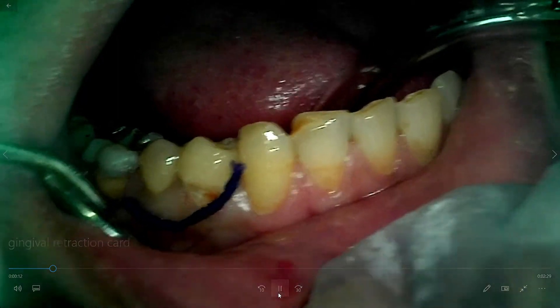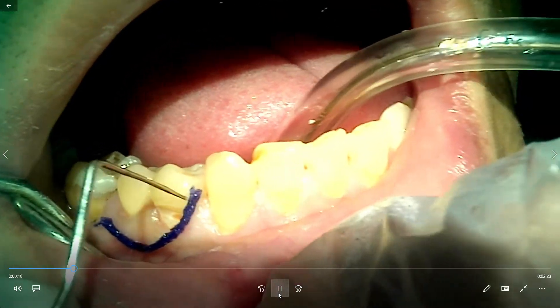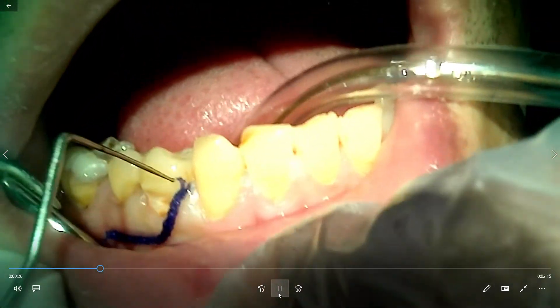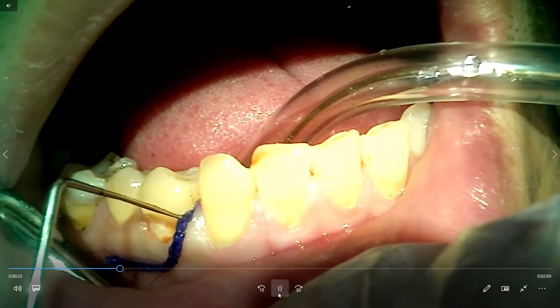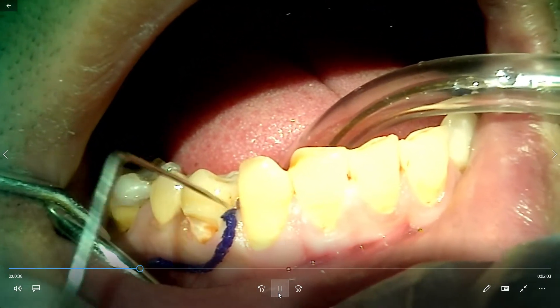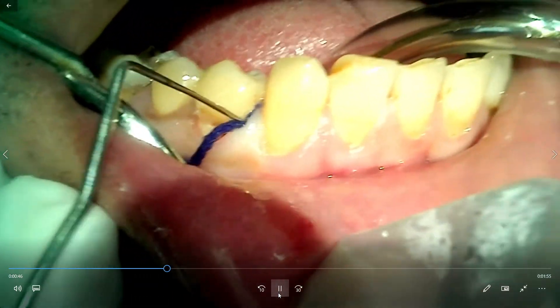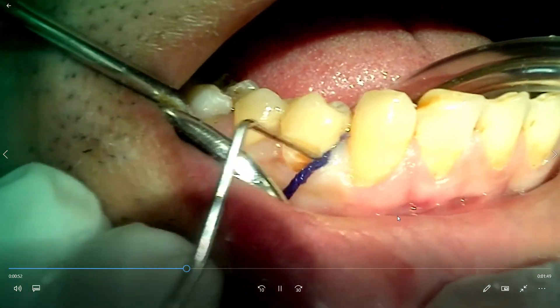Here you can see a class 5 lesion. It is having a more thick biotype, and a retraction cord is used to retract the gums. This is the ball-ended periodontal probe, which is used to place the retraction cord. The plastic instrument can also be used, or even a spoon excavator, but the ball-ended periodontal probe is a better choice, especially if it is a thin biotype.